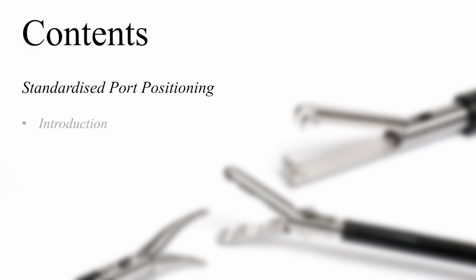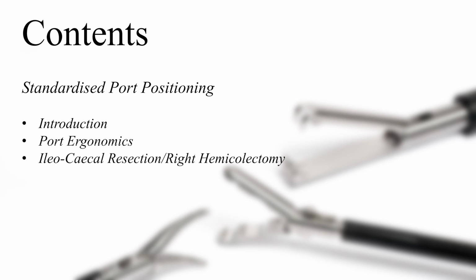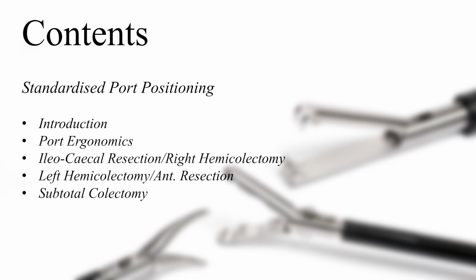In this video, we're going to present a standardized technique for port positioning in laparoscopic colonic resections. After a brief introduction, we're going to discuss port ergonomics, and then we're going to proceed in a detailed description of port positioning for right, left, and subtotal colectomies.